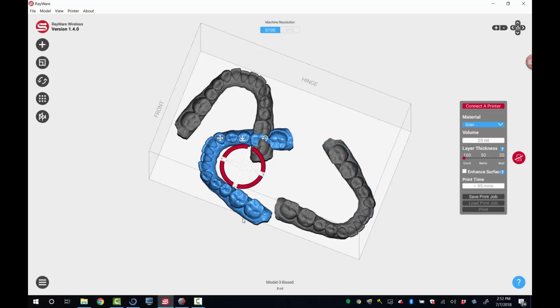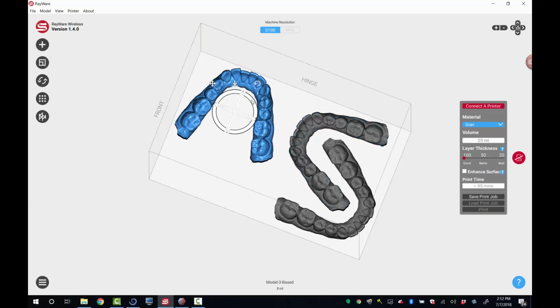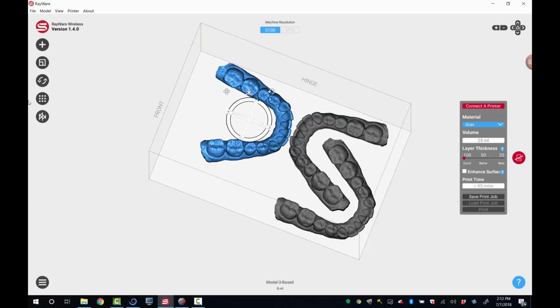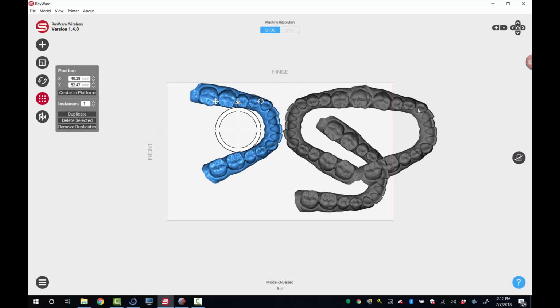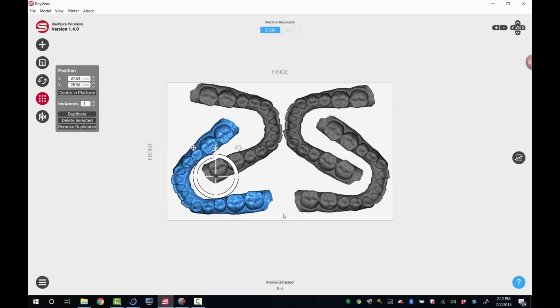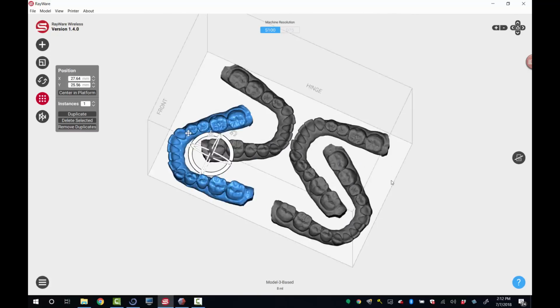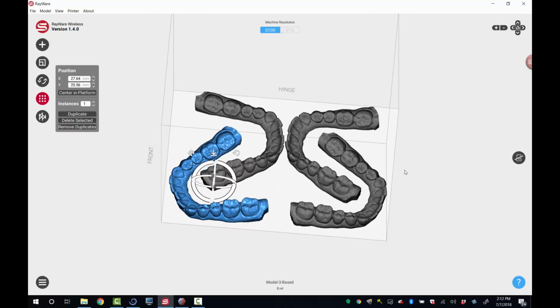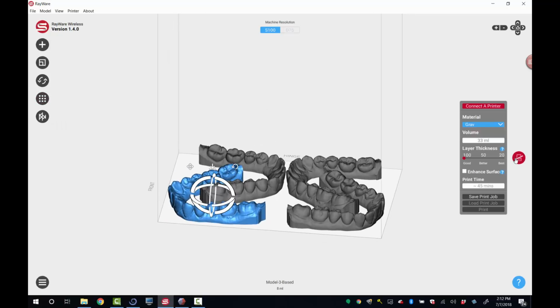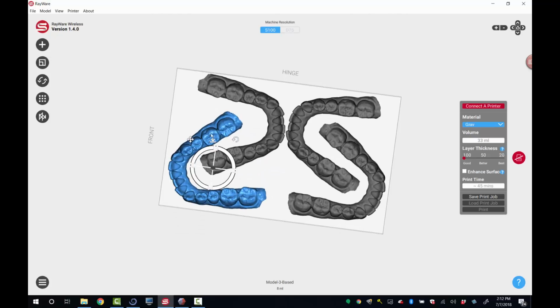And I'll bet, I wonder, sorry for wasting time, but I can't help it. Yeah, this is how I should have oriented them. There you go. So 4 models, same 4 as we had last time. Takes up about the same amount of space because those platforms are so big when you do the supports and everything. But in about a quarter of the time. Just over 1/4 of the time. Okay, so let's go ahead and get rid of these.